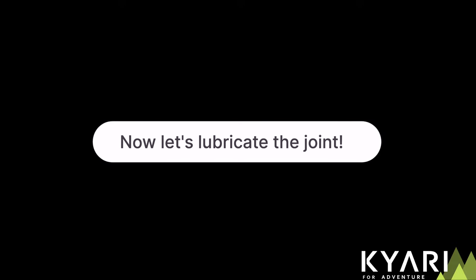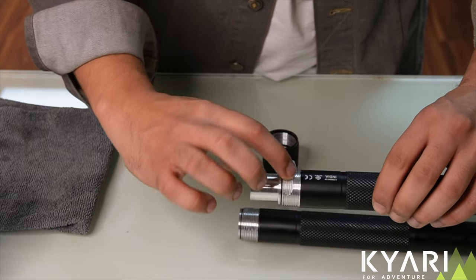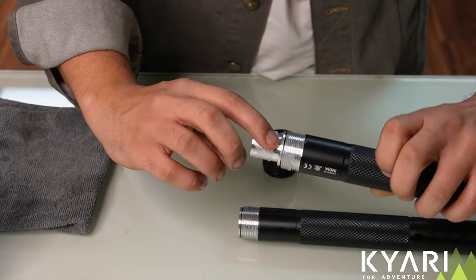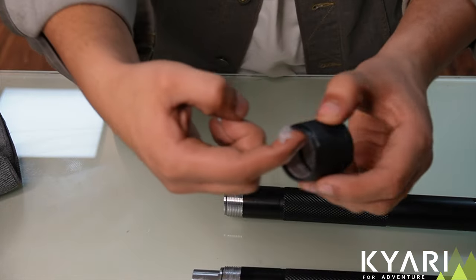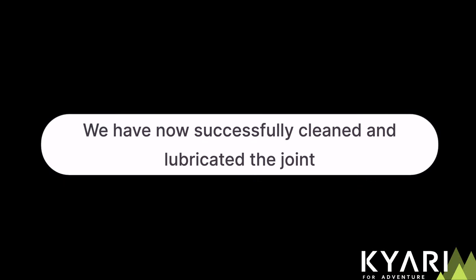Now let's lubricate the joint. Take any petroleum jelly and use your fingers to apply the lubricant. Make sure you apply the petroleum jelly properly all around the threads of the stick and the socket. Gently clean off the excess petroleum jelly using a clean cloth. We have now successfully cleaned and lubricated the joint.